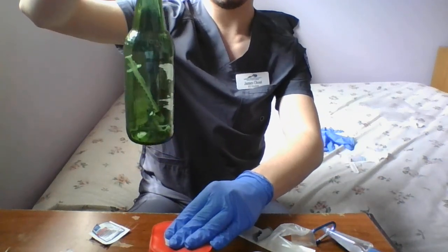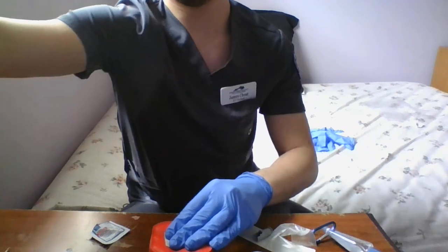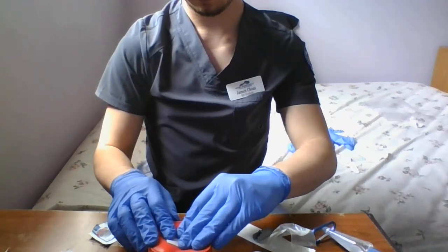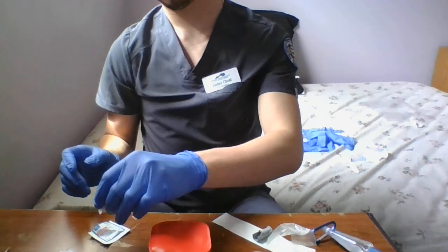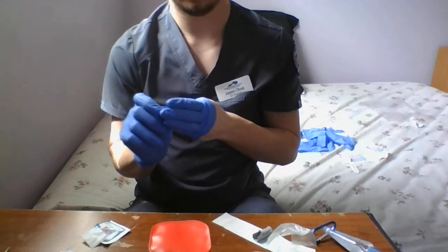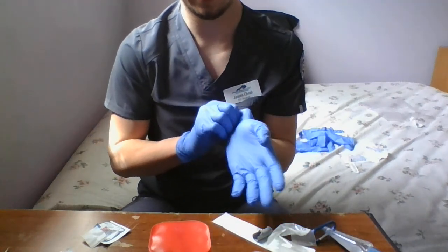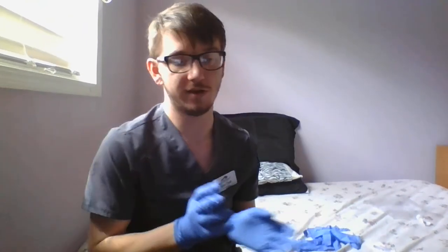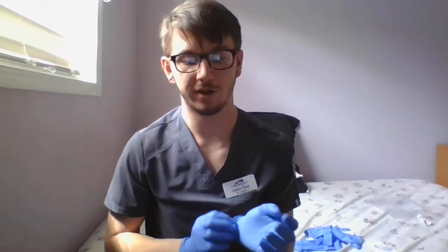Different bottle, sharps container. It's in there. I applied pressure, and the expiration on the heparin was also 0228, so still within the normal range. It's not expired or anything.